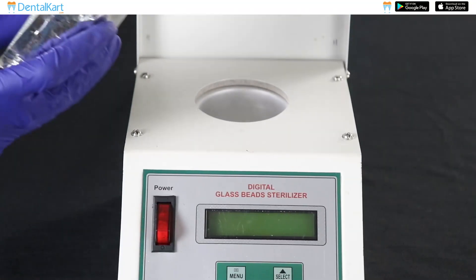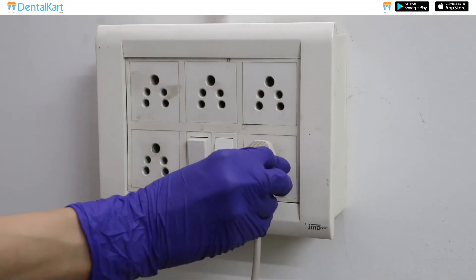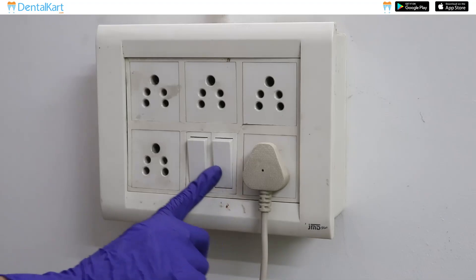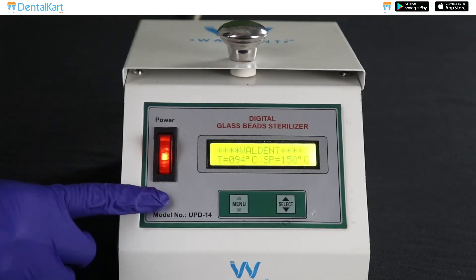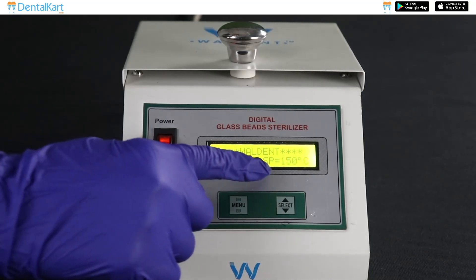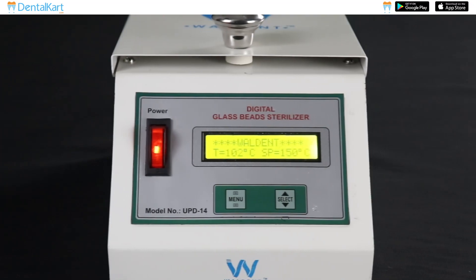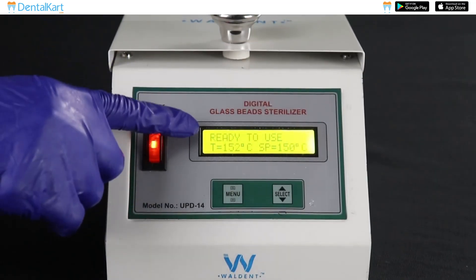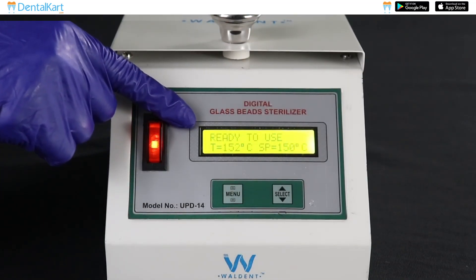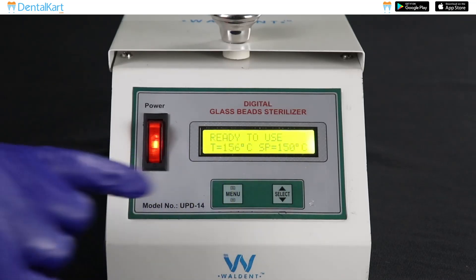Start the procedure by filling the well of the glass bead sterilizer with glass beads. Plug the sterilizer into an electrical outlet and turn the power switch on. As the unit is switched on, you can check both the current temperature and the set point, which is 150 degrees Celsius. The current temperature will keep increasing until it reaches 150 degrees Celsius, at which point the display will show the message 'ready to use' with a buzzer sound.